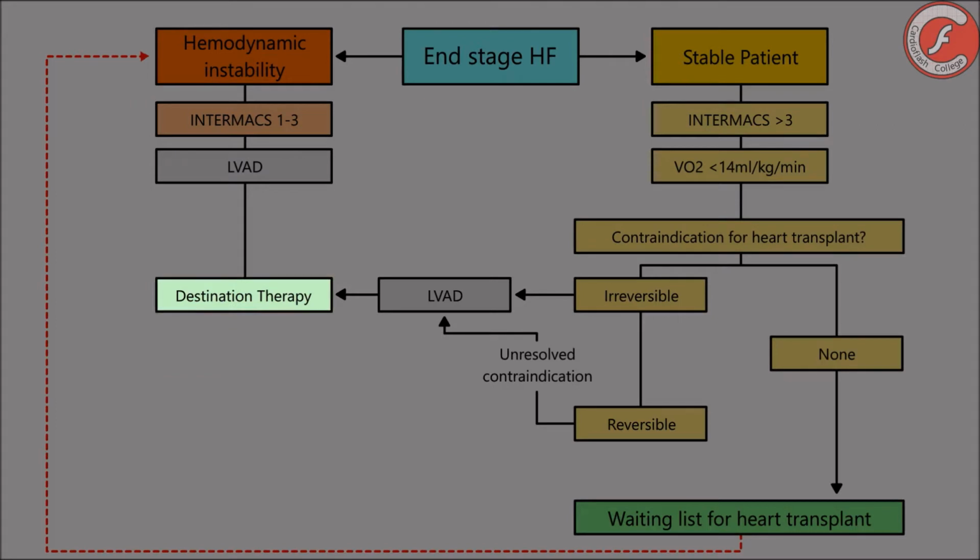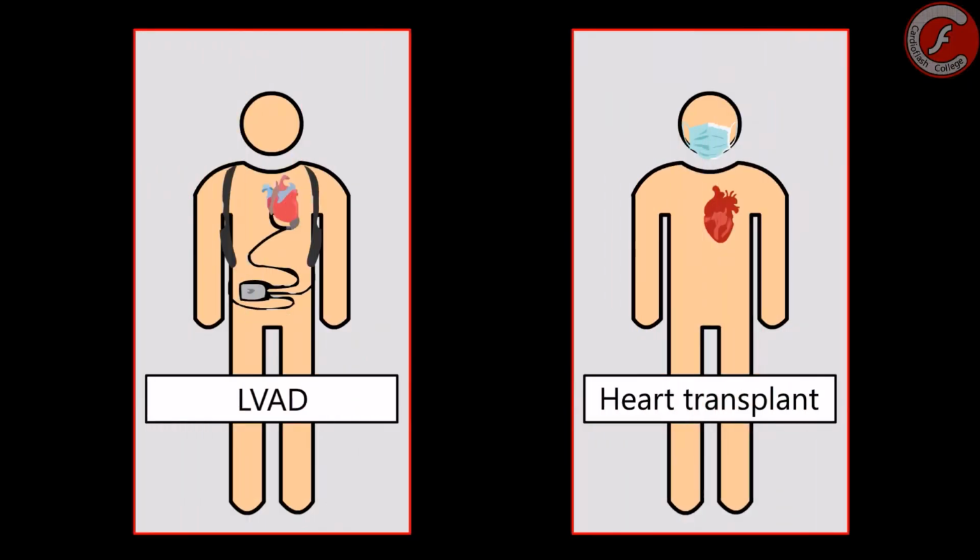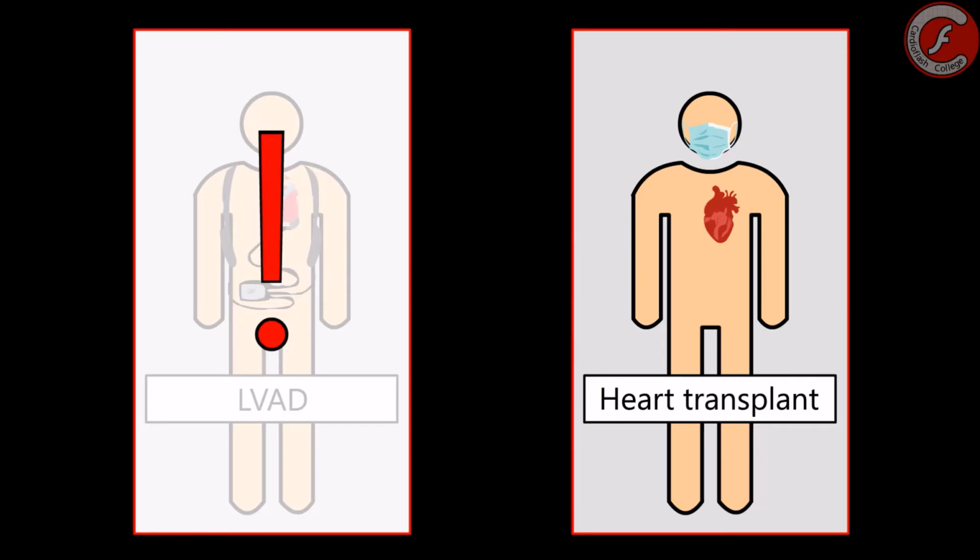Finally, with regard to destination therapies, we can say that although LVADs are not approved for this purpose in all European countries, they are frequently used as destination therapy in daily clinical practice, because, as you know, many of the patients who receive LVAD as a bridge to transplantation die before receiving the organ, since the lack of transplantable hearts is increasing. However, it must be made clear that LVADs cannot currently be used to replace heart transplantation, since current models still have many technological limitations and a not inconsiderable rate of complications during follow-up.